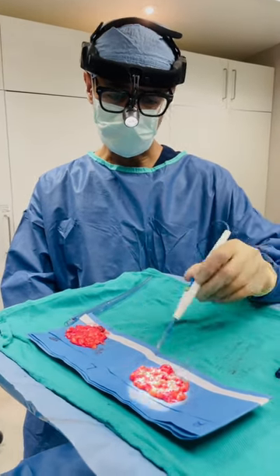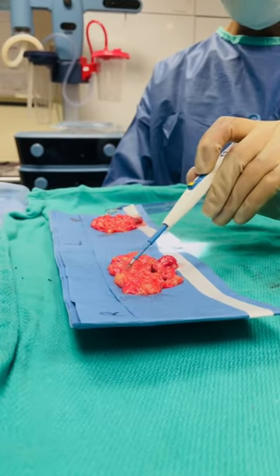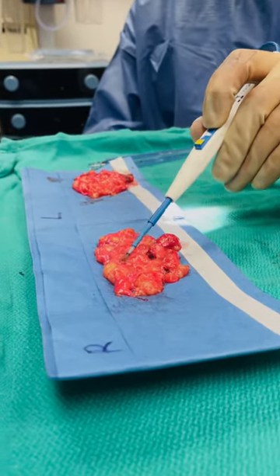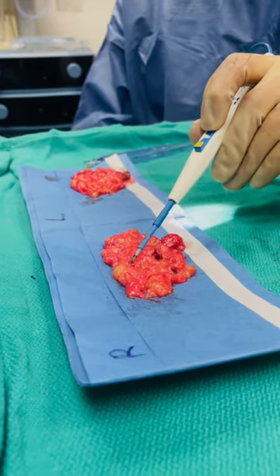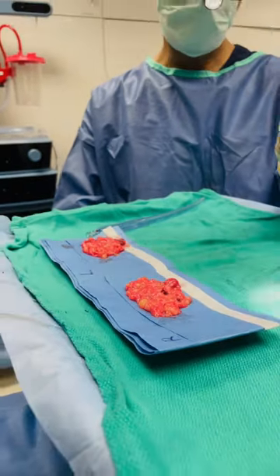This is the breast tissue. I'll try it on the tissue so you can see — it's charged the tissue there, but if this was a bleeding area it would stop that bleeding. Really useful tool.